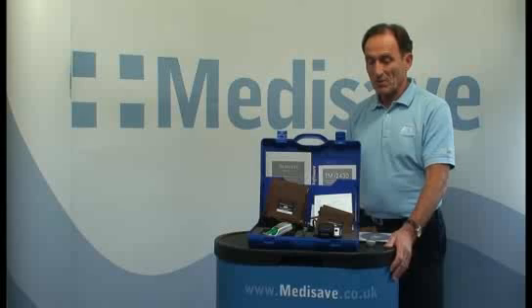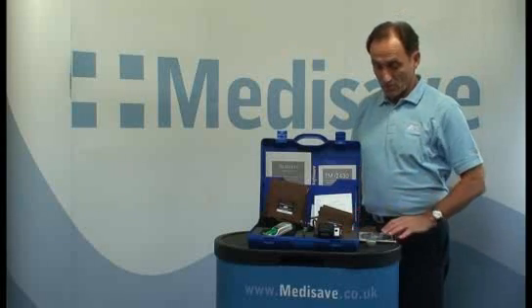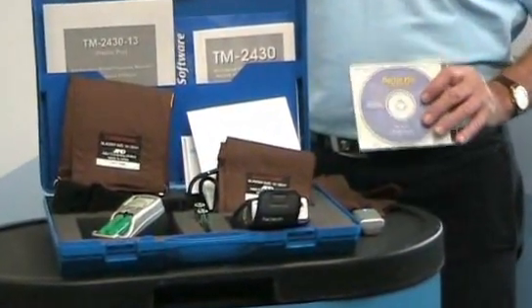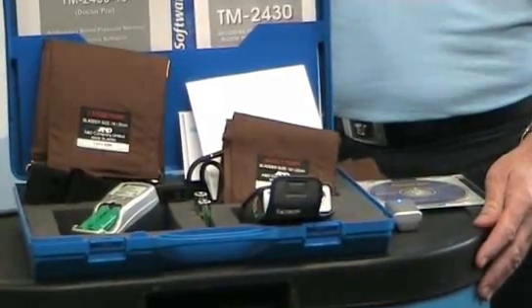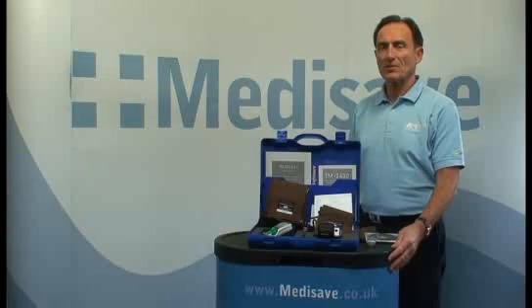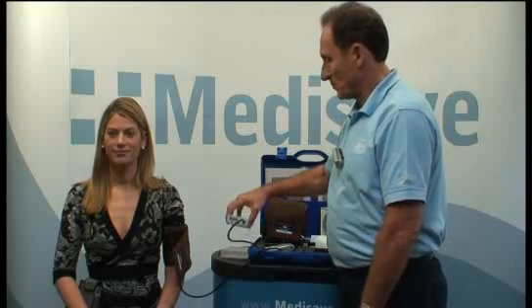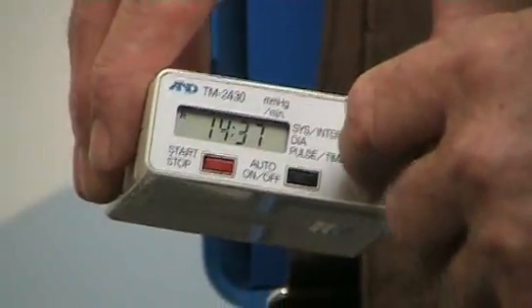The monitor comes complete with full equipment and, more importantly, the DrPro software for full analysis of results. The monitor itself is easy to set up and easy to download the patient's data onto the patient system. The TM2430 does come with full instructions but AMD also supply a quick start guide. The monitor here has already been preset to the correct time and we will demonstrate how it should be attached to the patient.